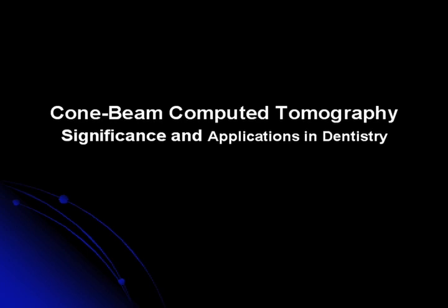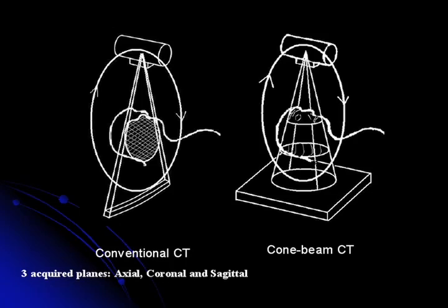So I'm going to talk a little bit today about cone beam CT and applications in dentistry, specifically different disciplines of dentistry. So let me go ahead and get started. So cone beam computed tomography is increasing in significance in the field of dentistry right now. There are a lot more applications that it's being used for, and it's becoming standard of care. So I'm going to discuss a little bit about what a cone beam CT is.